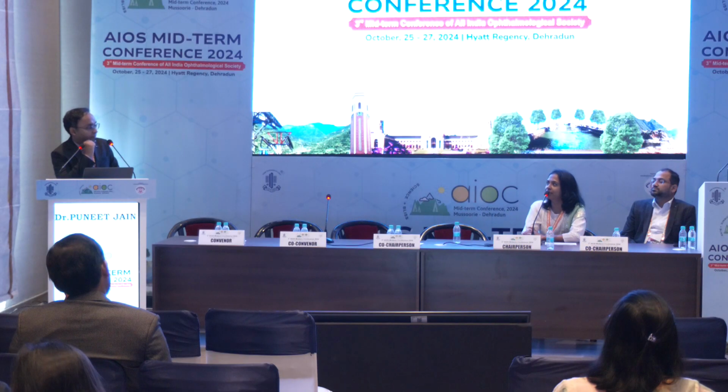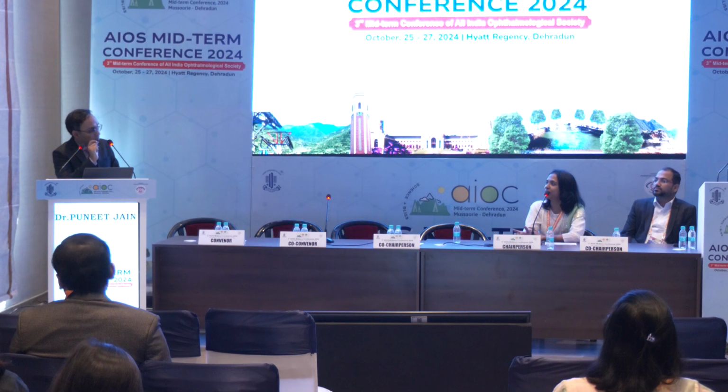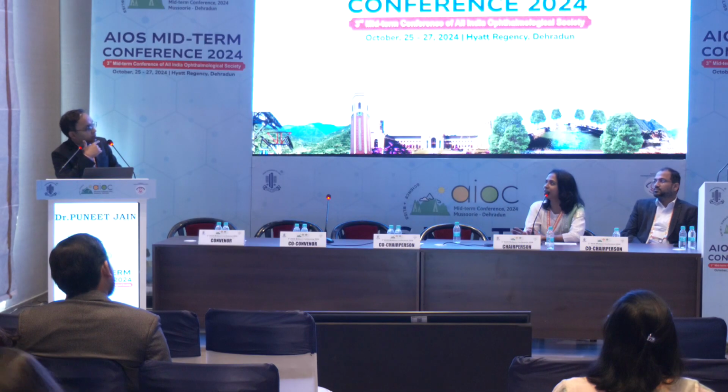Yeah, and I had another situation where we removed it. There is a large pseudopterygium now. So it looks doubtful after a few months whether ASOCT will give me an insight. Once you have operated and then you are trying to image something, it will just show fibrosis. Fibrosis has no typical features on ASOCT, so it will just look like a thickened epithelium. That is the problem in recurrent tumors which are not operated. You don't have a biopsy report and the patient comes back to you, and whether ASOCT will help us in knowing, because it's showing some surface changes now.